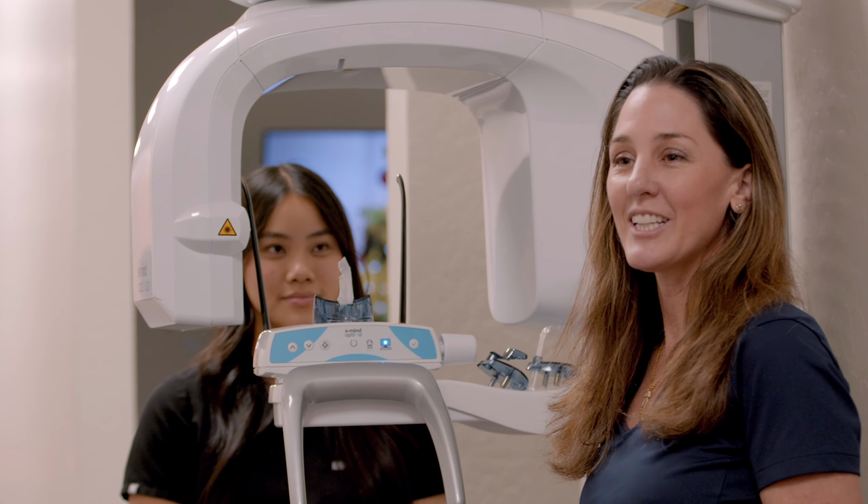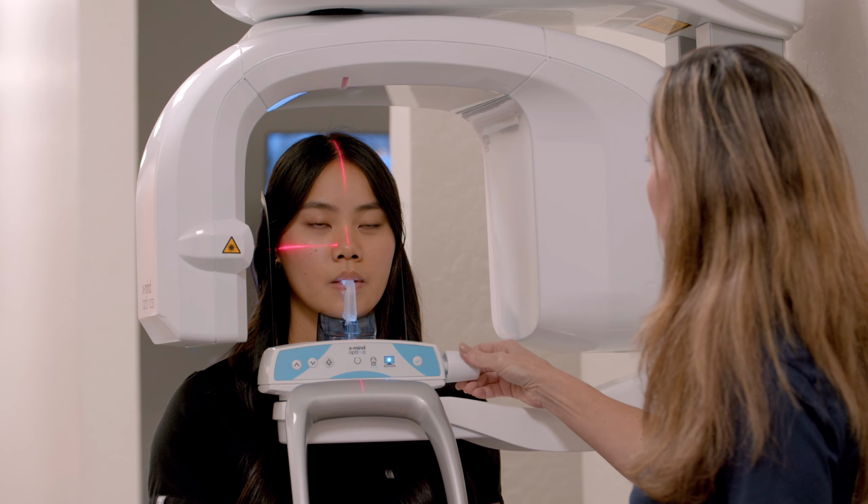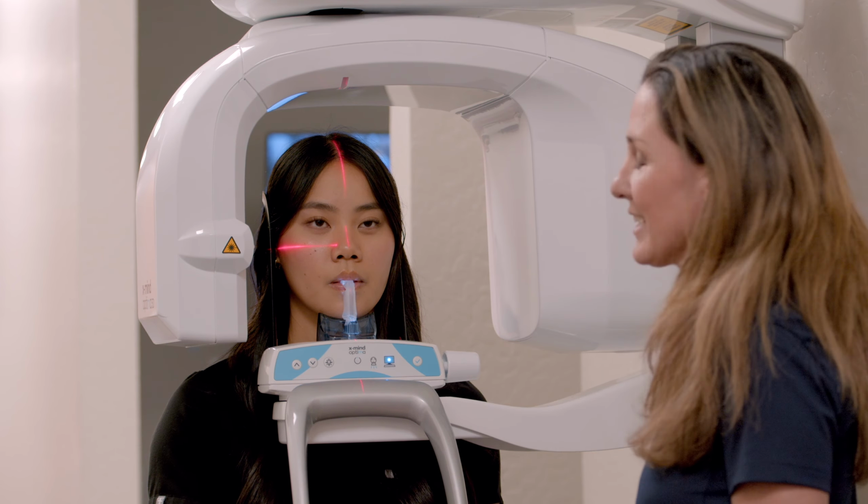And from there, if everything looks good, I can go ahead and secure Vicki in. Does that feel okay? All right. And then we would step out and we would acquire the image. So while Vicki's in the unit and we've selected our pano, we would on the machine be hitting our little checkbox to allow the unit to know that we are ready to take that image. And you can see right up here that the unit is ready and there is a gray bar up at the top.